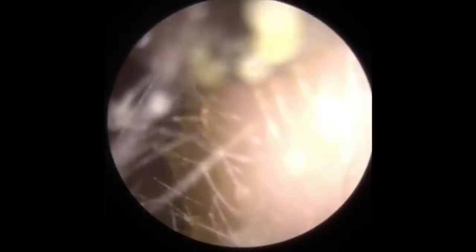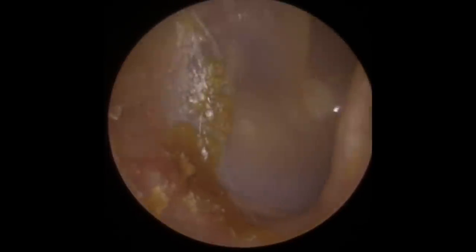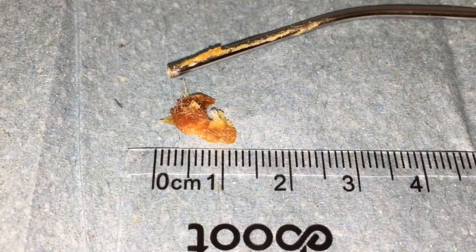Trying to unstick this now from the canal walls. There we go, it's just starting to move - you can see how sticky that is, how stuck it is to the canal walls. You could use a little bit of olive oil, which will sometimes reduce the adhesion. There we go, that's the piece we were trying to get to. You can see we've got another piece which is just in front of the eardrum there. So I'm going to leave that sticky piece attached to the eardrum - it's going to be so sticky that it would cause damage to the eardrum. I'd rather let baths and showers wash that away and let that naturally come away on its own.